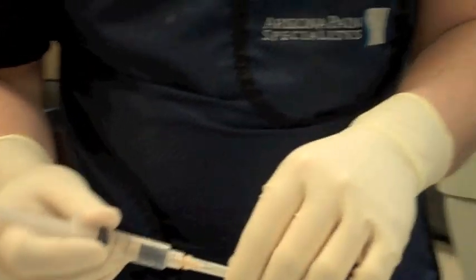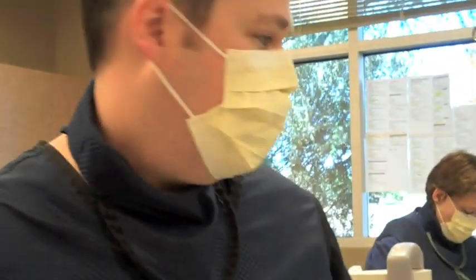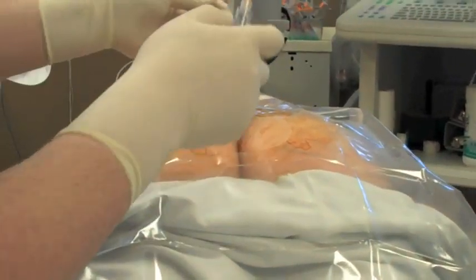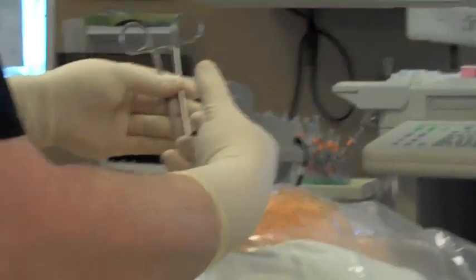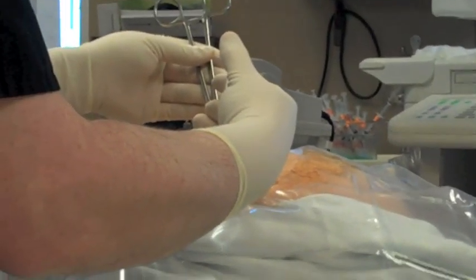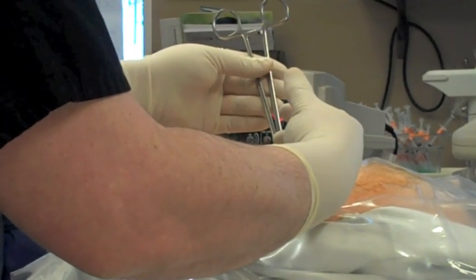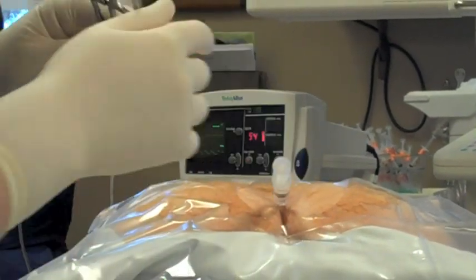I'm going to go ahead and numb up the skin now. This is for the sacral hiatus that we numb the skin. You're going to feel a little sting and burn here — numbing medicine going deep down. It's going to hurt for about 10 seconds, then it's going to numb all the way down. Numbing up real good for you there.